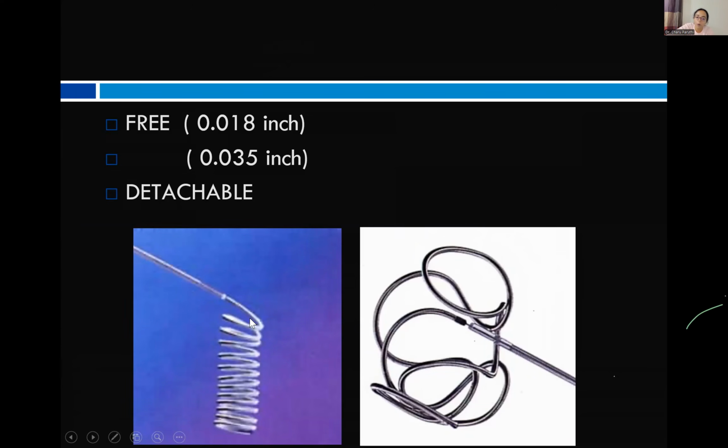Helical coils have this helical structure, and 3D coils have this 3D structure. Whenever we talk about the size of the coil, we talk about the diameter of the loop of the coil and the length of the wire. This structure which we are seeing of the coil is a tertiary structure of the coil, and this diameter is usually the diameter of the coil.